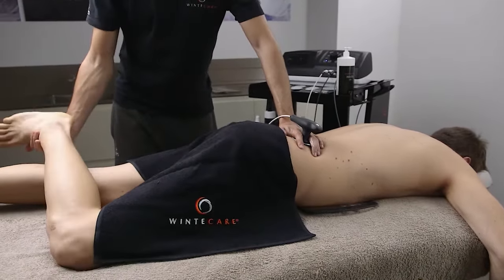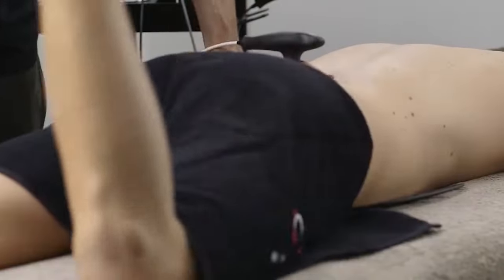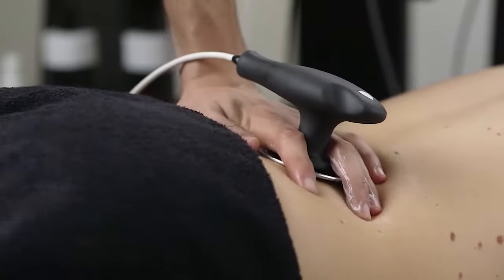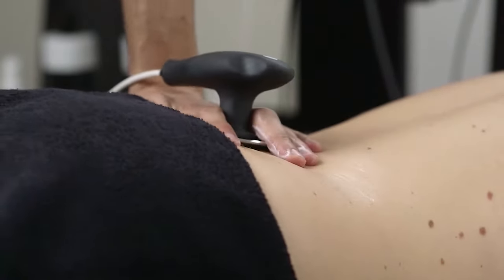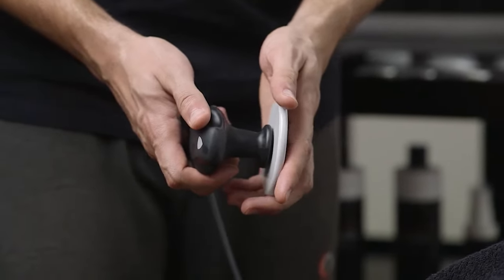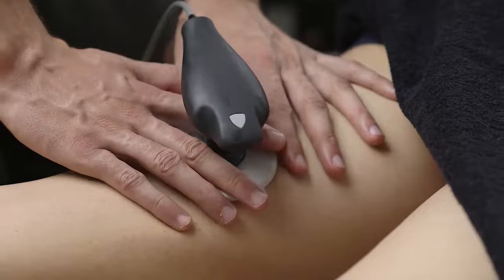T Plus is the tool that, more than any other, minimizes the superficial increase in temperature, promoting the absorption of energy in the targeted tissues. It is the only one in the world that has been tested and measured for this purpose and whose results are published in Impact Factor Reviews.